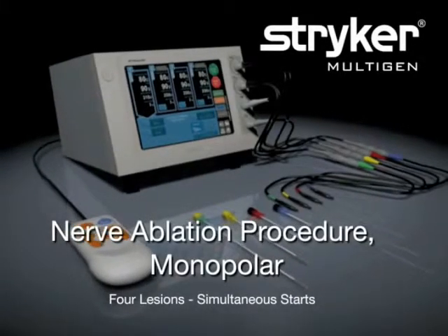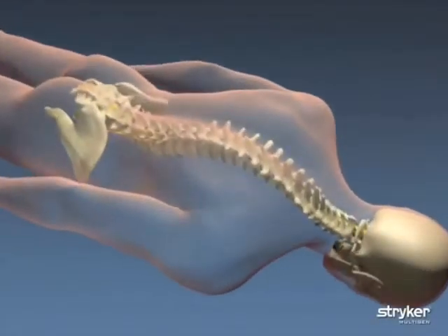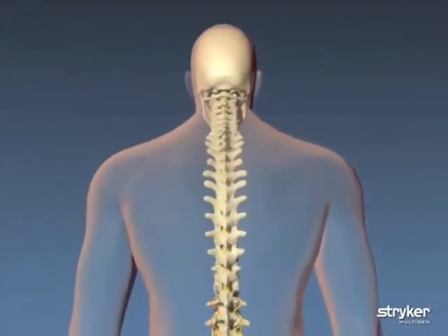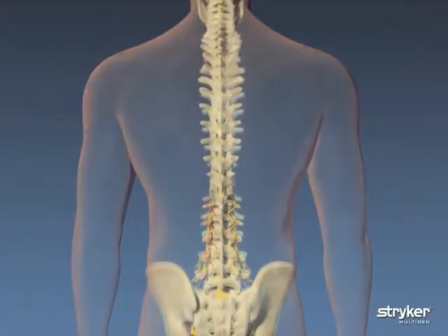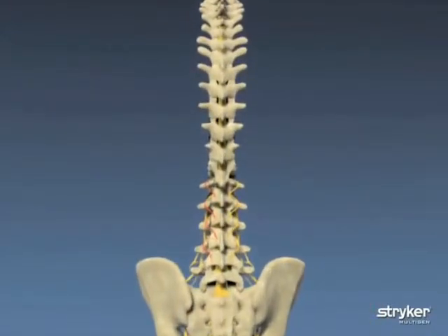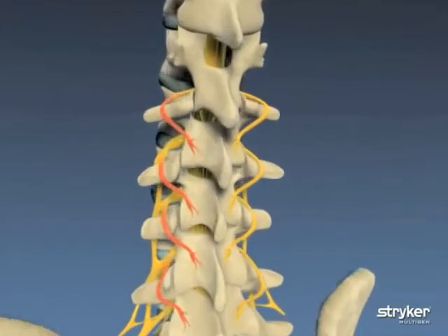Stryker Multigen is indicated for use in various types of radiofrequency neurotomy procedures. For this example, we'll demonstrate four thermal lesions with a simultaneous start on the lumbar spine. This particular neurotomy procedure works by disrupting the pain signals that are sent from the inflamed nervous tissue in the lumbar spine to the brain.